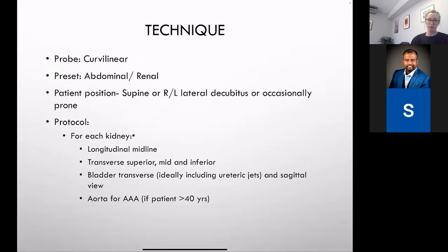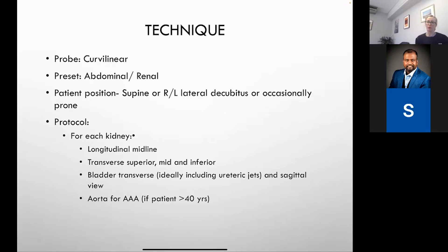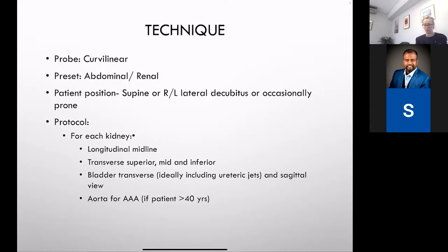You'll probably need to use a curvilinear probe with a low frequency, somewhere around 1 to 5 megahertz, with an abdominal preset. Some advanced machines will have a renal preset specifically. The patient needs to be assessed in the supine position as well as in some other positions. Normally we try to do it in a lateral decubitus position, because it's much easier to scan the kidneys from the flank region — similar to where you'd feel for renal angle tenderness.